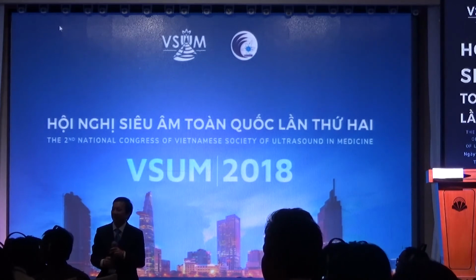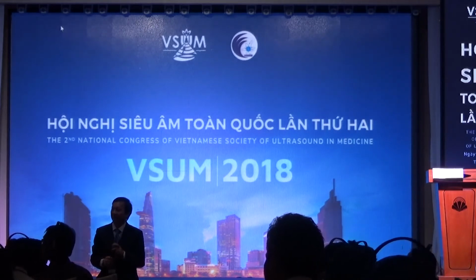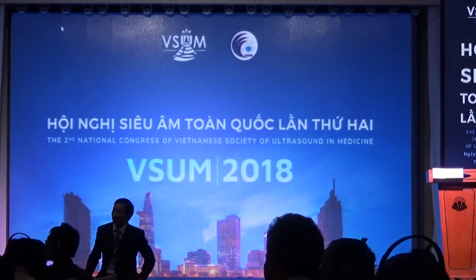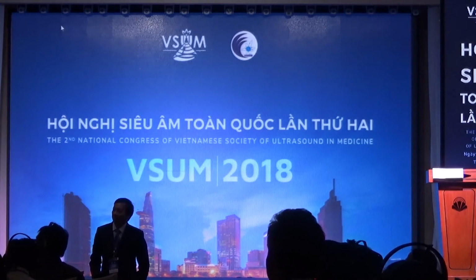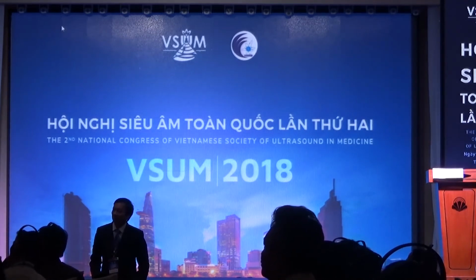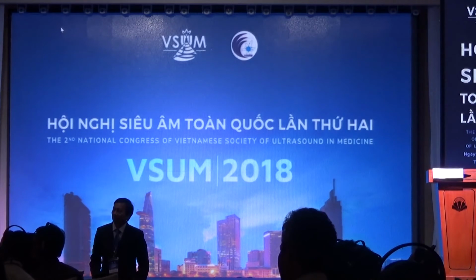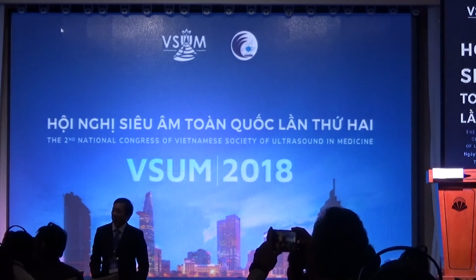Sir, in a hospital where we are working, assume a situation where we are using multiple vendors' ultrasound machines, for example GE, Siemens, Philips, and different companies have got different cutoff values for liver stiffness. So my question is, how should a doctor understand which vendor is accurate, or which values we should actually take into consideration for our interpretation? Because Siemens gives some different values, Philips gives some different values, Aloka, Toshiba, all companies give different values. So as a radiologist, how do we trust which vendor is more accurate or more precise?